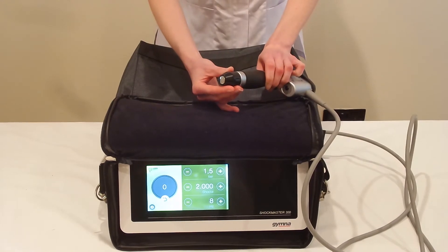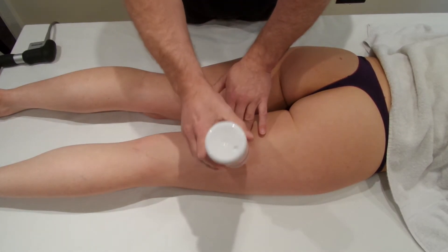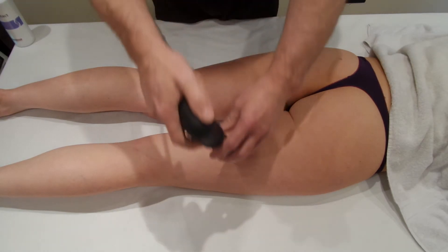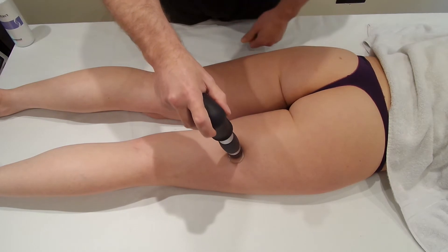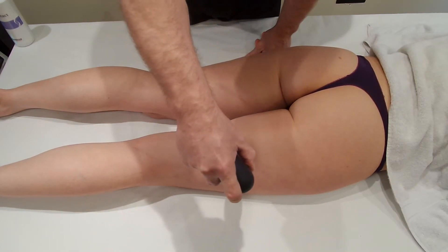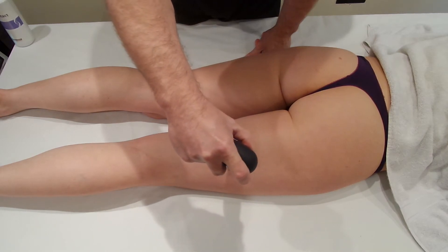Apply some ultrasound gel to where the tight areas are — where the trigger points are, as people would call them. Apply the gel onto the area, bring the head onto the area, and just push it in nice and tight. Then we're going to do this in 200-spot increments, so as you're doing the spots just move the head around, get some good angles, multiple angles.